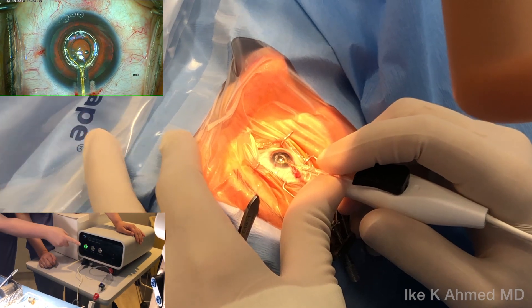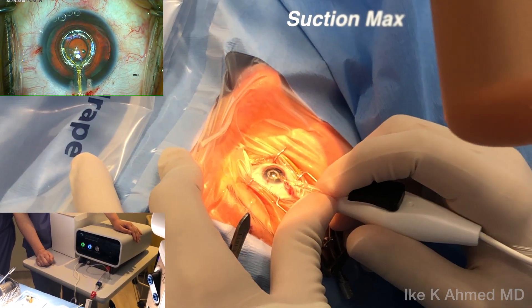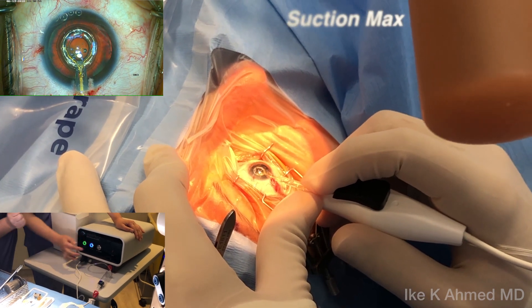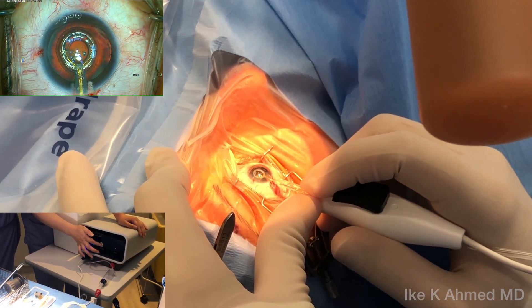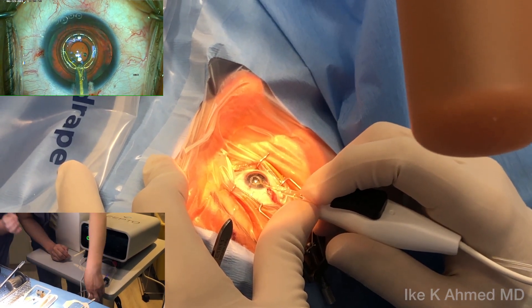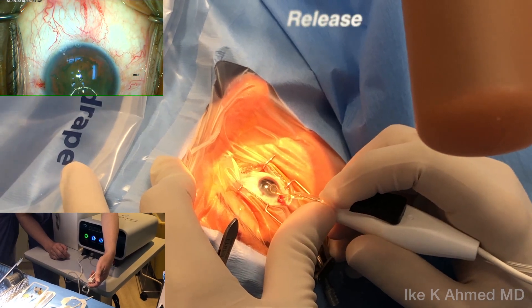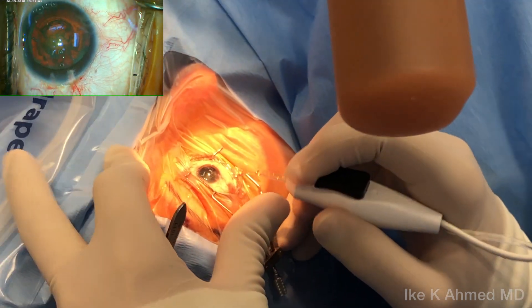As soon as we see this, we pull the slider all the way back, so we have the pushrod all the way back. We now hear suction max, and at this point we can ask the energy to be applied. Within 4 milliseconds the cut is made and energy is applied. Within 2 seconds, we will ask our assistant to release the suction, and now we have created a nice circular capsulotomy.